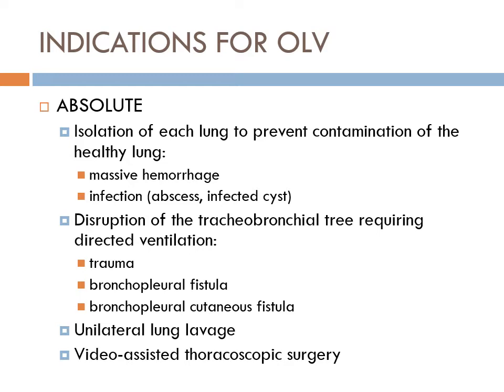So we'll say this dotted line is your vocal cords. Does the cuff go below or above the vocal cords? It goes below, right? So there's always a chance that there could be something on top of that cuff when you deflate the cuff, which makes you wonder how you should deflate the cuff at the end of the case, right?